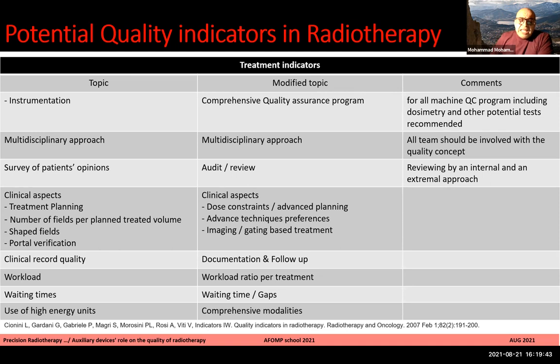And for the clinical aspect, instead of having a treatment planning system, we can go further and substitute those constraints with advanced planning. And advanced technique preferences, imaging, gating, double check, and lots of other things depending on the quality of treatment you desire to install and implement in your department.